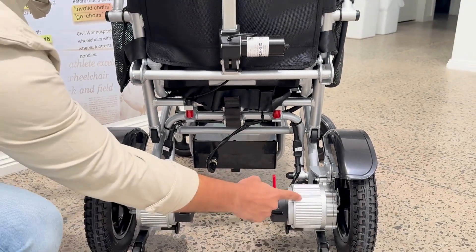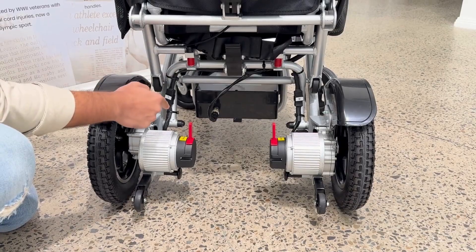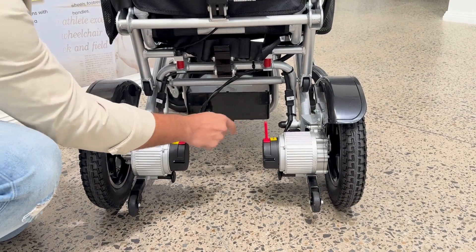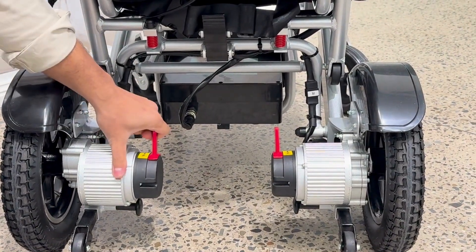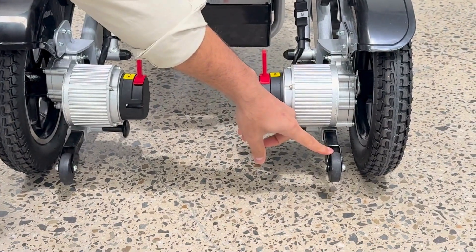This is the folding latch which is used to fold and unfold the wheelchair. It comes with two motors and two levers. These levers are used to switch this wheelchair from manually operated to electrically operated. Once you push this lever forward, it will be electrically operated; once you push it backwards, it will be manually operated. It comes with two anti-tip wheels for extra safety.